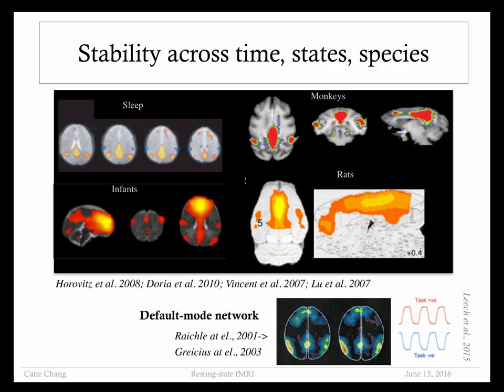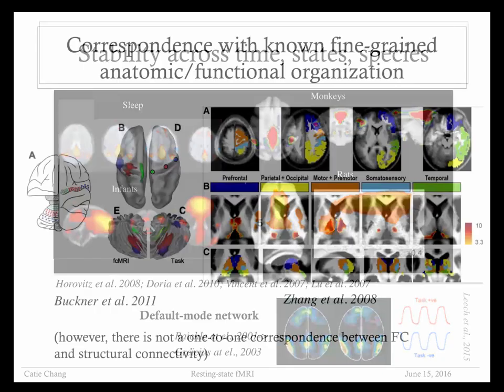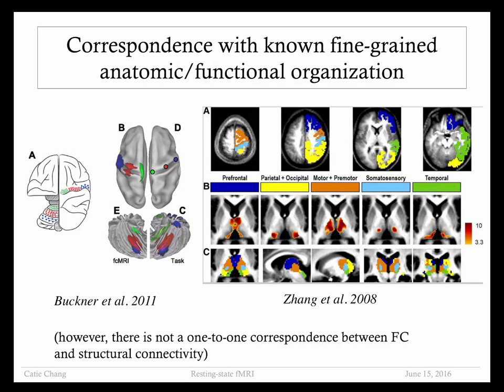Can I ask a question? Yeah. For these resting state scans, is it typically spin echo or gradient echo? So that will really depend on the type of study you're doing. Mostly they're conventional resting gradient echo acquisitions, but if you're looking at maybe very high resolution or high field, then there may be reasons to look at spin echo.